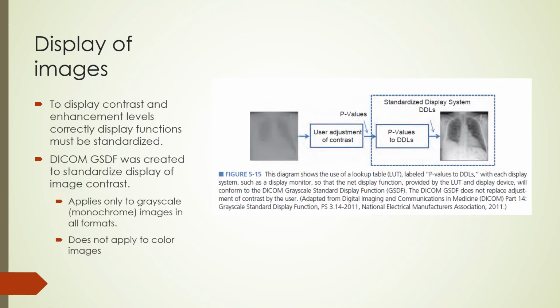The problem is that a display function on the acquisition monitor varies from monitor to monitor and may also be different from the display function on an interpretation monitor. So images may not be properly displayed when transferred from one monitor to another. To resolve this problem, the DICOM GSDF was created to standardize display of image contrast across different monitors. DICOM stands for Digital Imaging and Communications in Medicine, and GSDF stands for Grayscale Standard Display Function. With this standard, interpretation monitors having identical minimal and maximal luminances will provide almost identical displays of contrast.